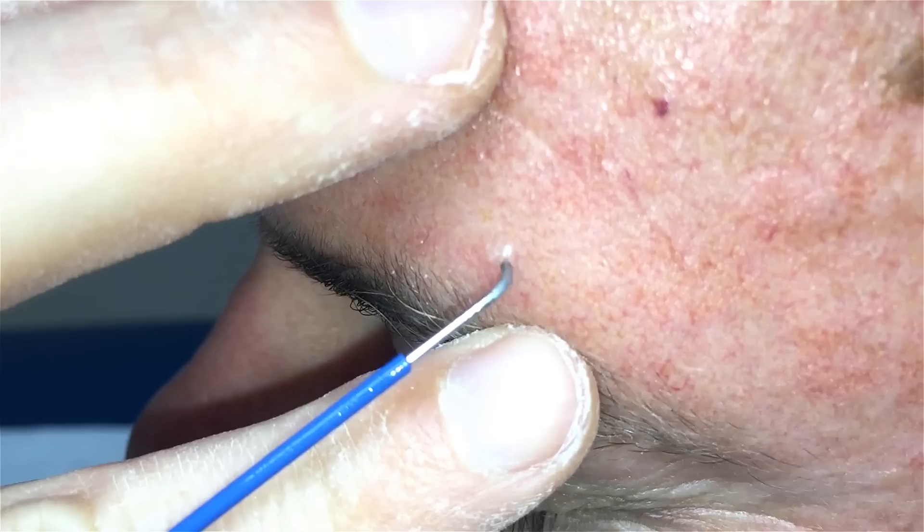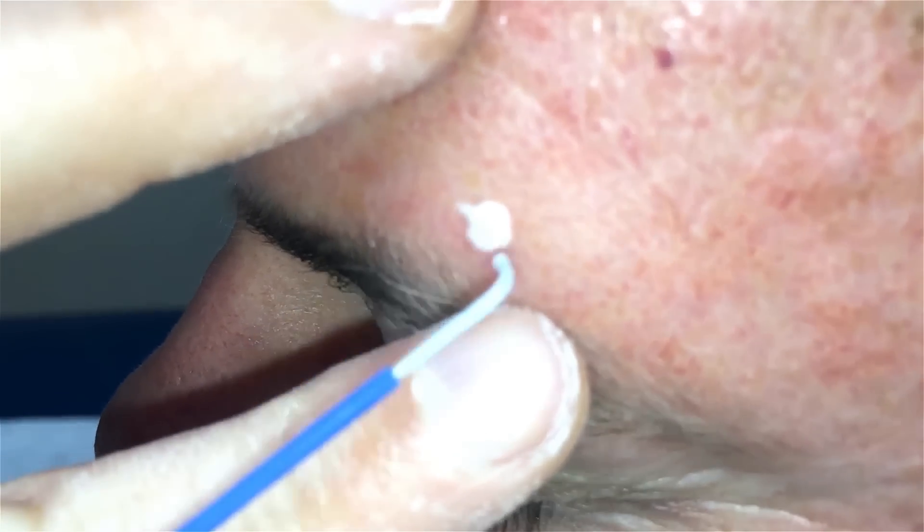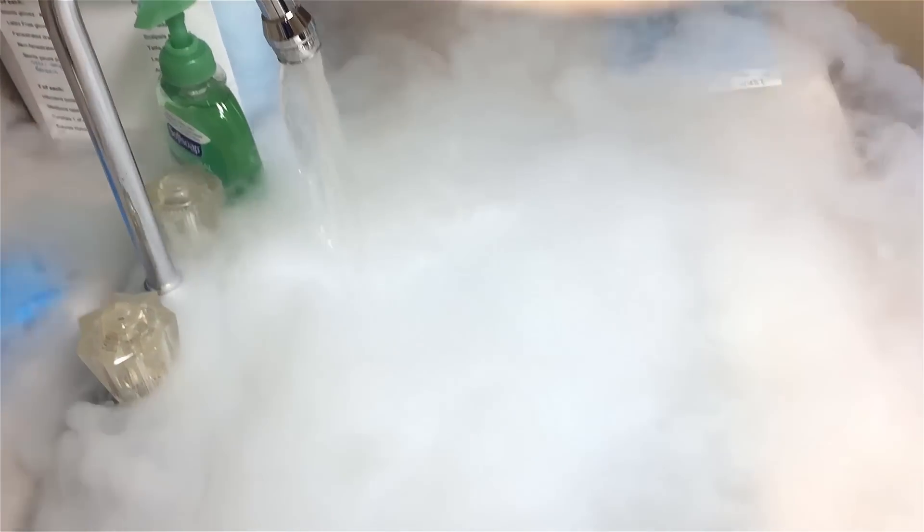Dr. Mark Vaughn of the Auburn Medical Group, thanks for joining us. We are going to freeze off an actinic keratosis in the brow of Eric on the left side.